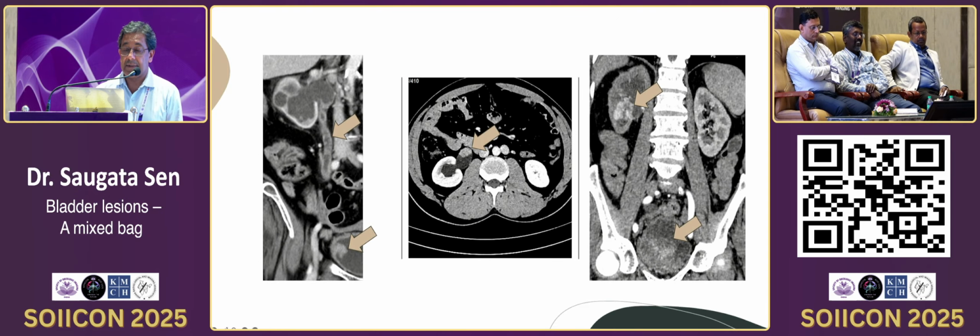Here is another case which is multifocal. You see all the arrows are given. You have a lesion in the ureter, you have a lesion in the bladder, you have a lesion in the pelvis. Here is another lesion in the renal pelvis and also in the urinary bladder. So what happens is the entire transitional cell epithelium undergoes an oncogenic change. It's very much like the oral cancer. In oral cancer you will sometimes find a lesion here, it's treated, then another lesion develops in some other place.